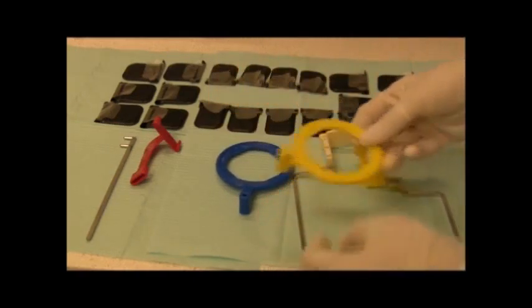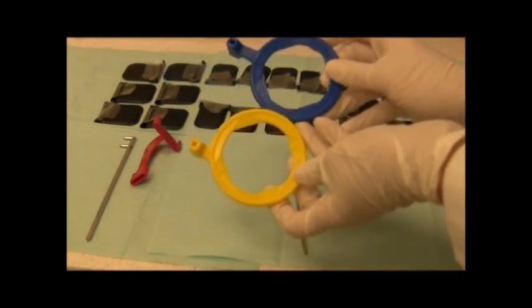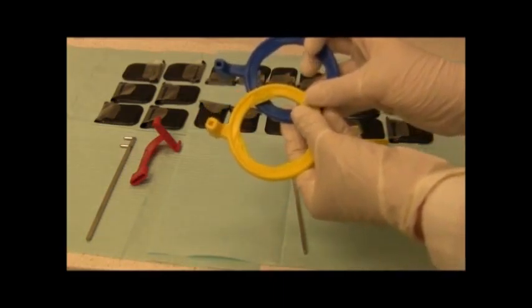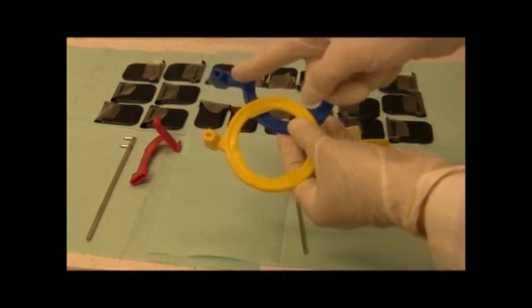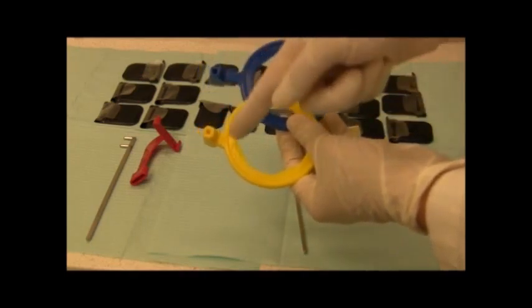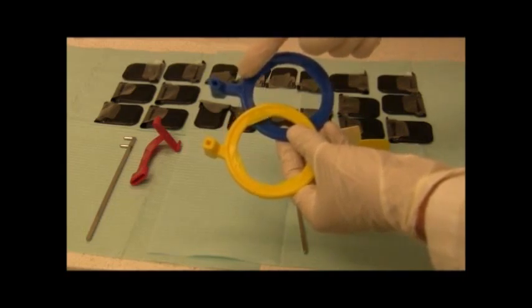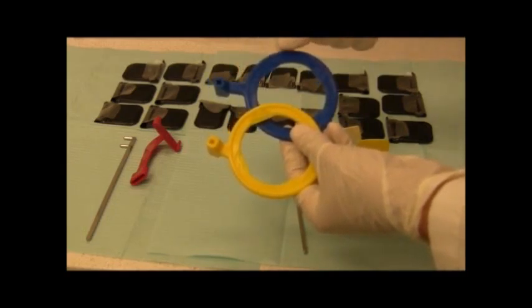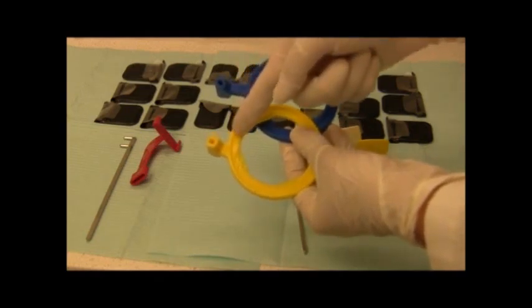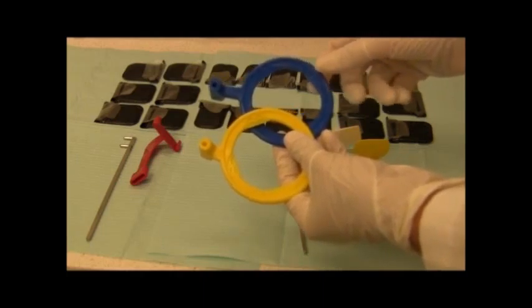You will notice that you have 2 rings. The difference in the 2 rings is their attachment to the alignment rod. One is centered and one is off-centered. The centered attachment is for use with your anterior periapicals and bite wing images. The off-centered attachment is for use with your posterior periapicals.